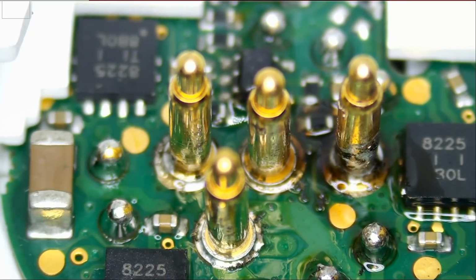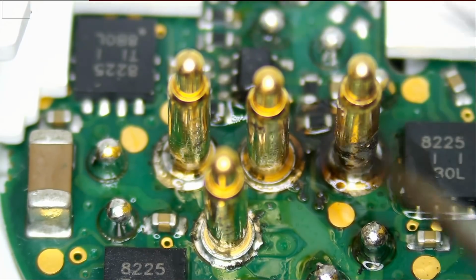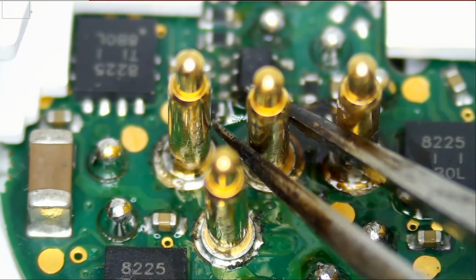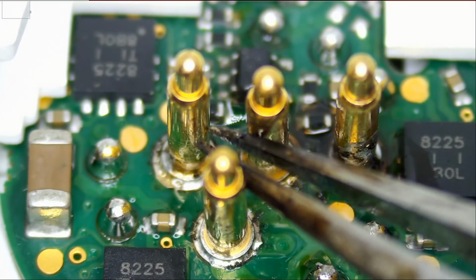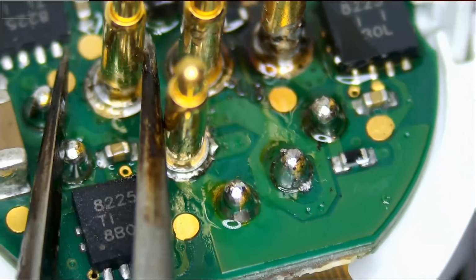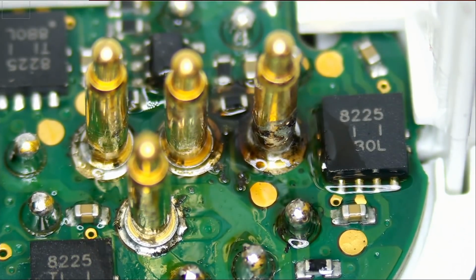All right, so we did an awesome job. We soldered all 4 pins. Solid, solid, solid, and of course solid. That's clean up.